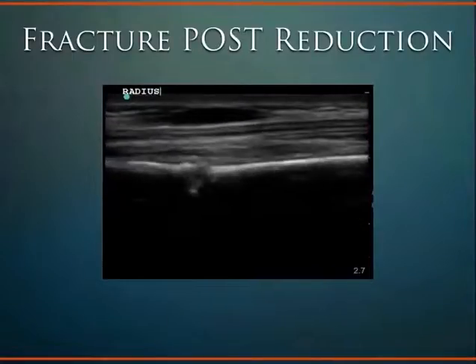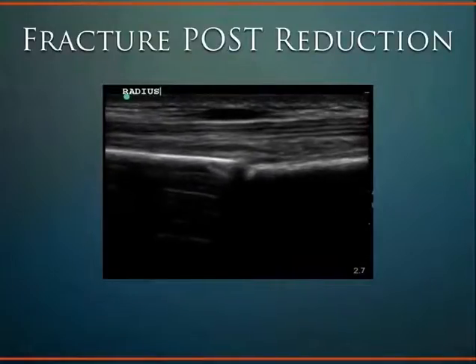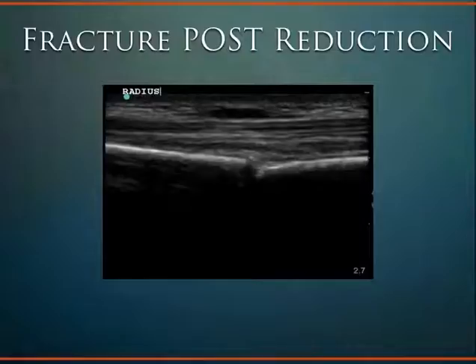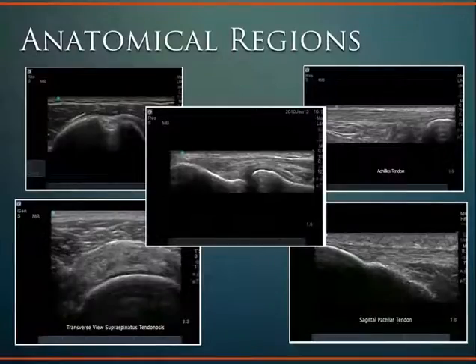If you've ever done this clinically by traditional methods, it can be quite cumbersome. You get the x-ray, you show the fracture, then you have to have the x-ray up, you're looking at the x-ray, you're trying to visualize the fracture, and you're moving it in the direction you feel is appropriate and by protocol. Then you have to splint it, and then you send them back to x-ray, they get another x-ray, and then they come back, you look at it, and it's like, oh shoot, we're a little bit off, got to realign it, and then get it good, and then splint them and send them back to x-ray. It's this cumbersome process, whereas you put the ultrasound machine on there, you're watching it, anatomical alignment, splint it, and we're all good. So it can be quite useful and to the patient's benefit.